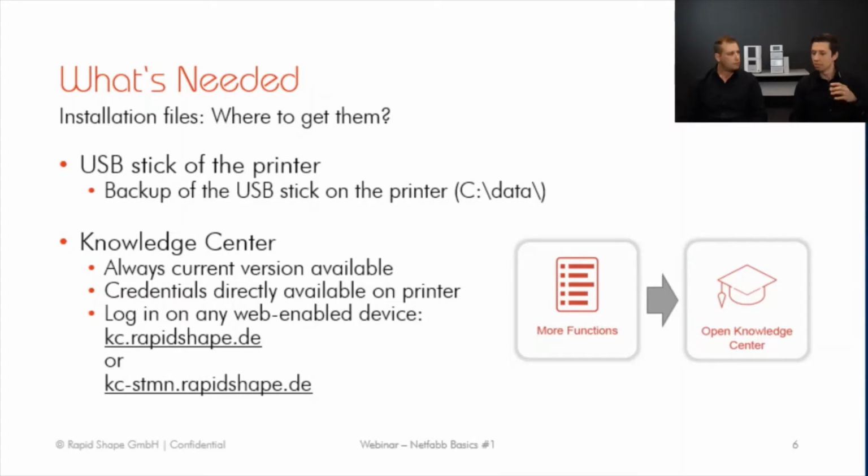As I already mentioned, in Netfabb we recommend always to use our software which is validated and tested already. Because it might be that Autodesk is already releasing an updated version which was not fully tested with our engine. And in order to avoid any issues in working with the rapidshape engine, we will always release the tested ones in our Knowledge Center, so there's no issues. Okay, that makes sense.